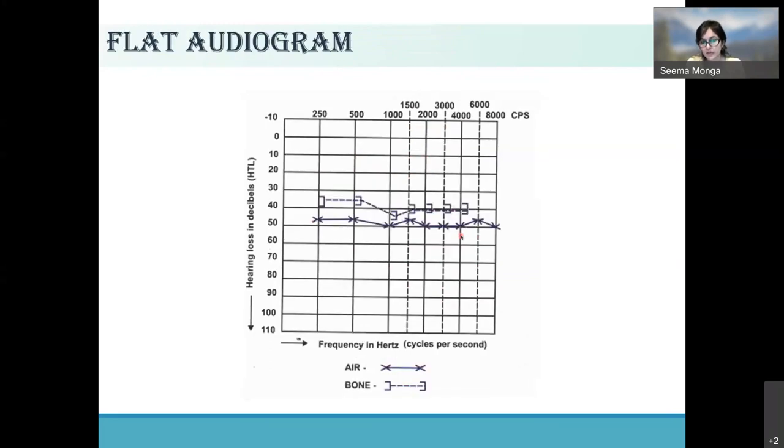This is a flat audiogram. All right, when do we call it flat? When it is not increasing in every frequency. All right, the increase is not much. It is almost the same. It is a flat audiogram. It is seen in which patients? Again, typical of strial presbycusis.